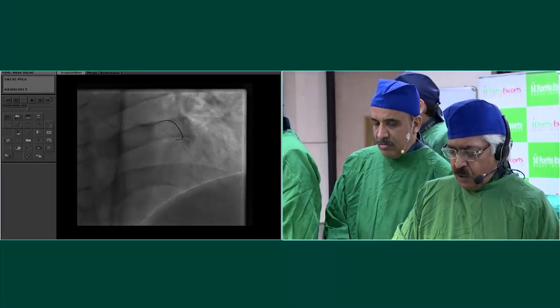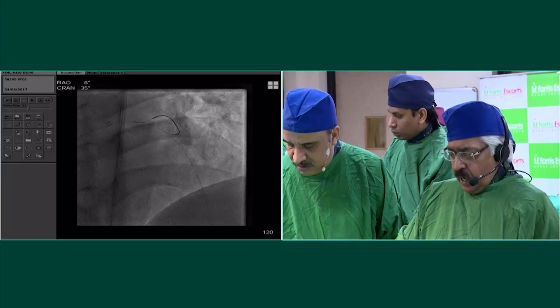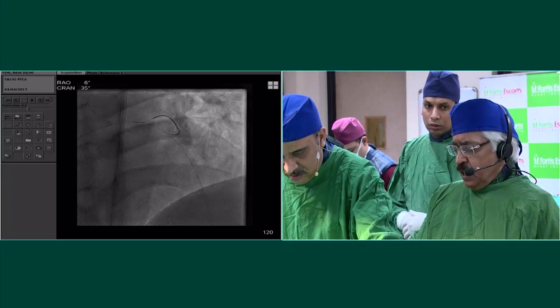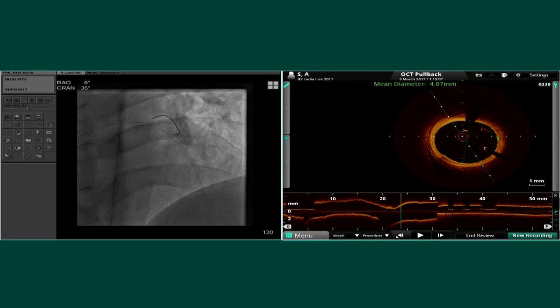Yeah, so I think that's one thing I'm going to do, and I'll show you the results. You can do that. Absolutely. Perfect. Yeah, I'll do a 4.5 at 3-4 atmospheres, and we'll see. So I think we have to move 8 millimeter, 1 minute to the 4.5. 8 millimeter.